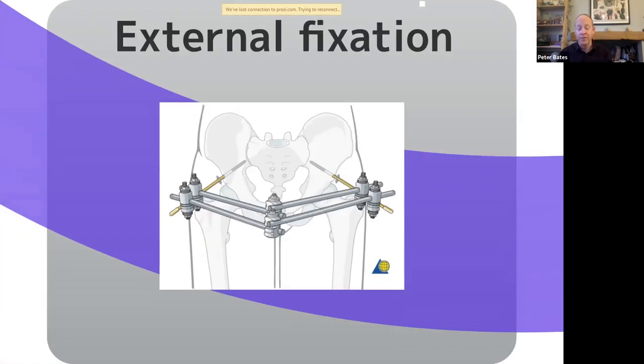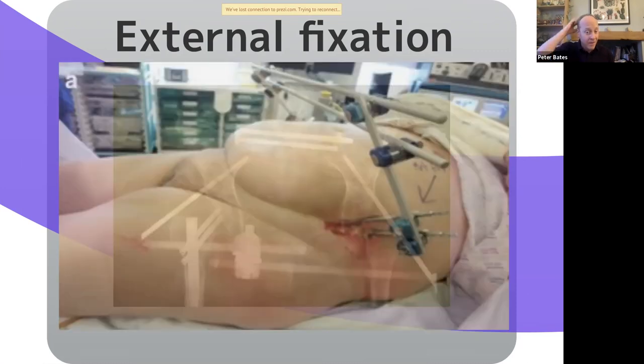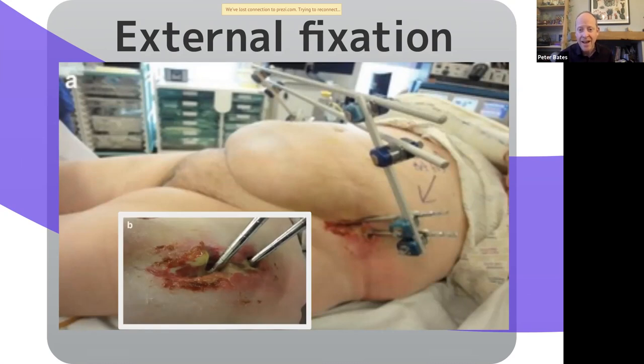Then you've got external fixation. Honestly, we don't use X-fixes very much anymore because they don't hold the pelvis particularly well. The downside of X-fixes is that the X-fix pins pus out really, really quickly. You can see, because they've got lots of tissue around them, the skin tends to necrose. You know, this sort of horrible picture here happens literally after a few weeks. So we do our best not to use X-fixes where possible.